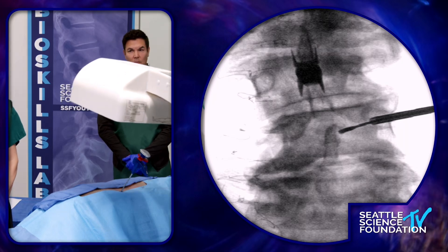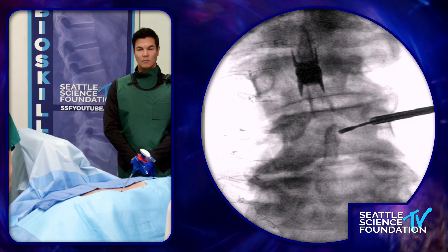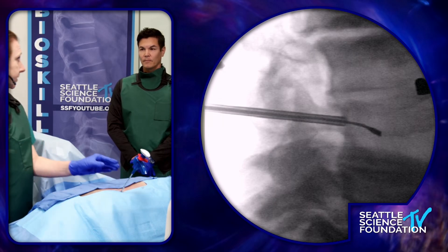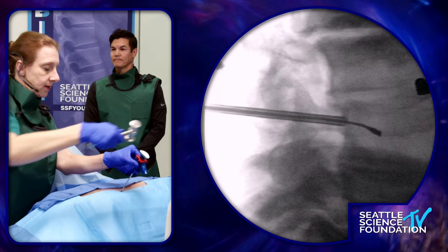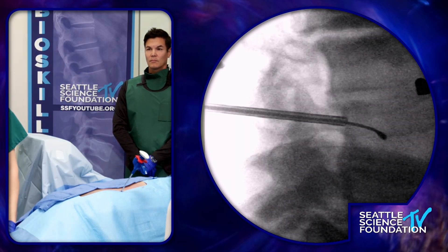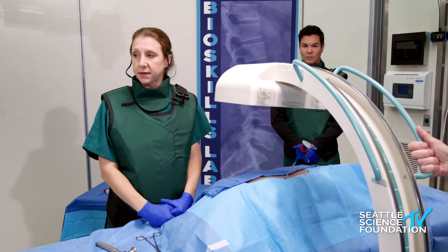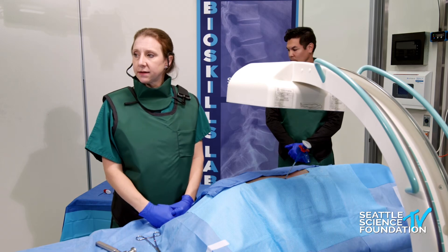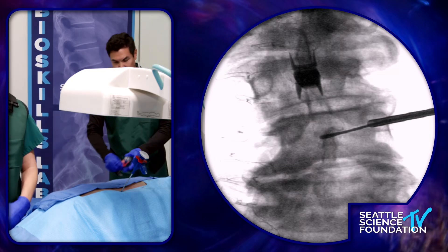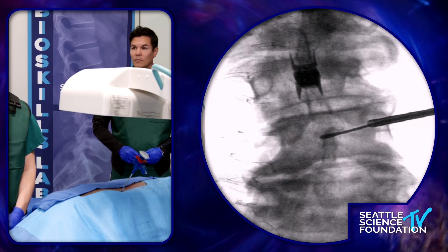I'm going to take a couple back-and-forth views as we finish off here. It's really shortening now. This may be a situation where I would use a J tip in order to extend a little bit further. The J tip is deployed all the way through the cannula, and it is straddling right over the spinous process, which it is — this actually looks really ideal. If you have a person with a broader vertebral body, you may find a situation where you deploy the J tip all the way into the introducer cannula and it doesn't quite reach the dorsal process, and in that situation you could use a J tip extension.